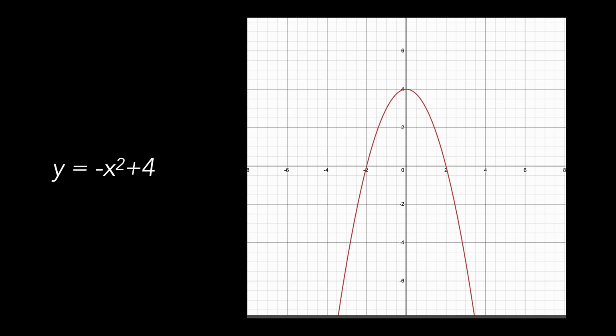And so when we try to calculate the volume, right, of the left ventricle, we can assume, let's take that parabola, let's flatten it out. And if we somehow can calculate the area of that parabola, the area under that curve, above the x baseline and then between the curves, and then spin that around its axis, we can then really easily calculate a volume.